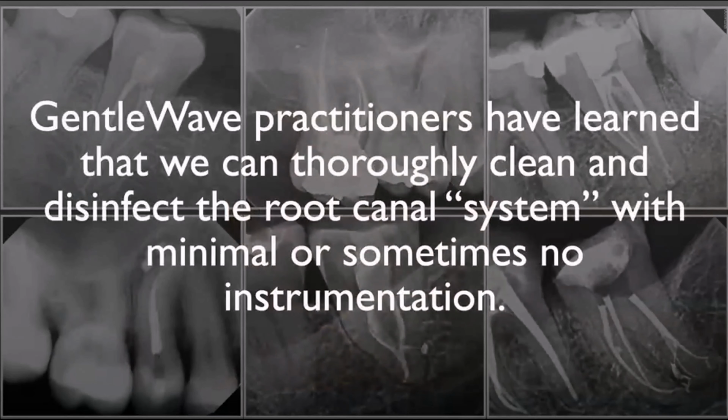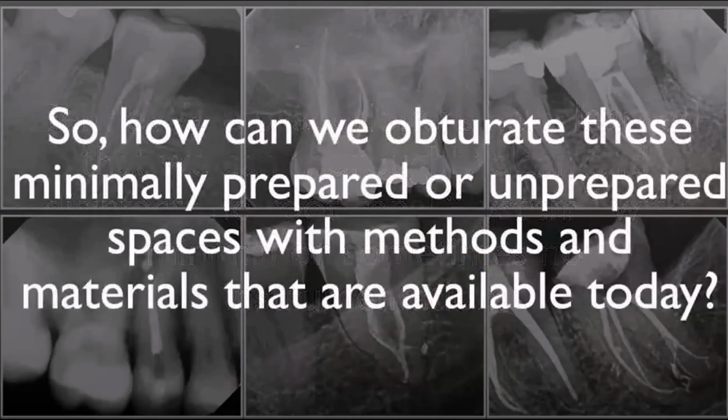We know that we don't need to shape the canals large when we're doing a GentleWave procedure, because GentleWave moves the fluid through those small shapes. If you go smaller, the difficulty is obturating those canal shapes predictably, without voids, without struggle. So that was a bit of a learning curve as well.